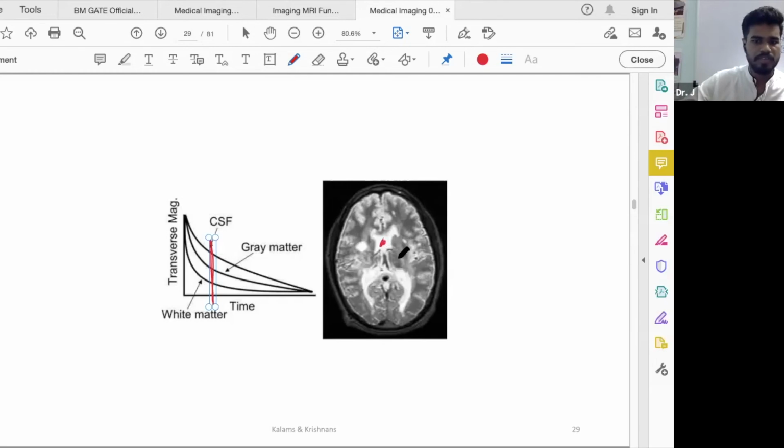This white matter is, relatively, where is the white matter? White matter is supposed to be dark. Okay, where is the white matter here? It's pretty dark, right? All these regions. Then we have the gray matter, which has middle contrast. All this, the boundaries. Fine? Clear?